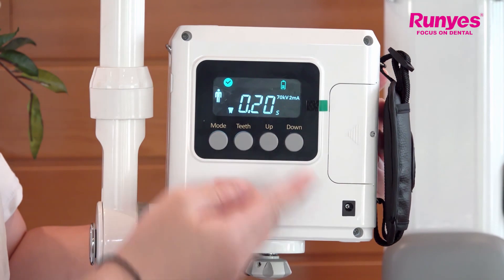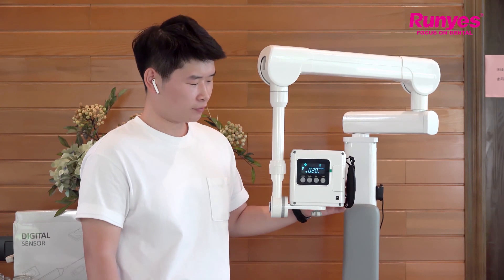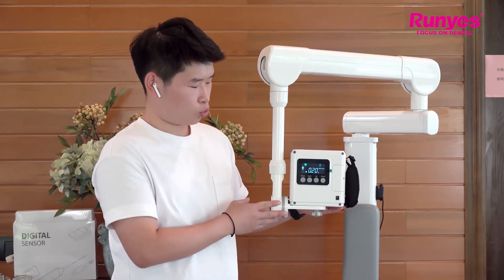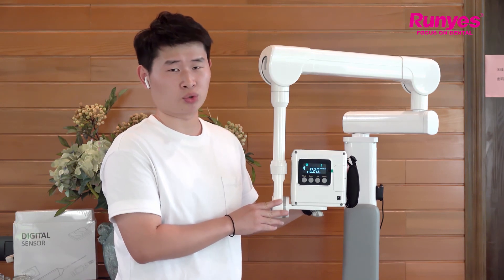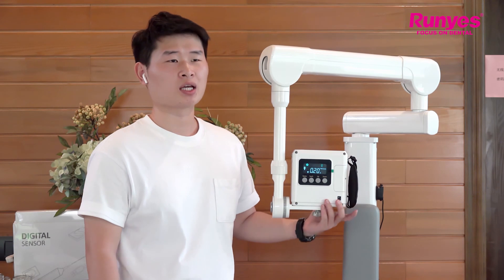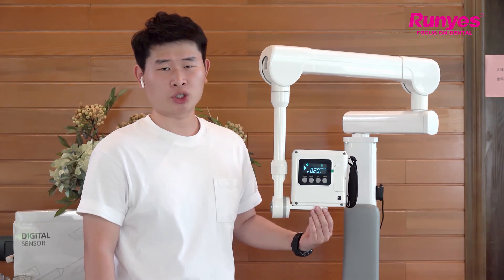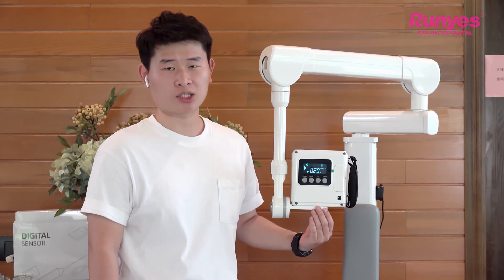We also have a battery protection function: if you leave the device for eight minutes, it will automatically shut down to save the battery. That's all for today's operation and function introductions. If you have any questions, please kindly contact us. Thank you.